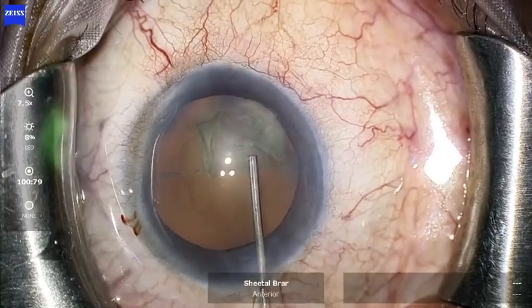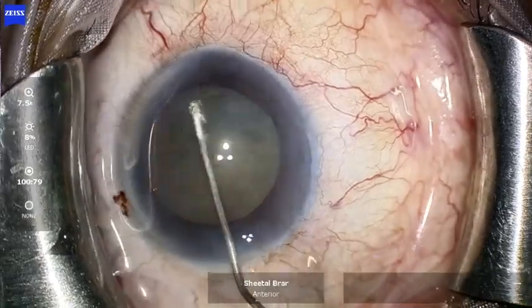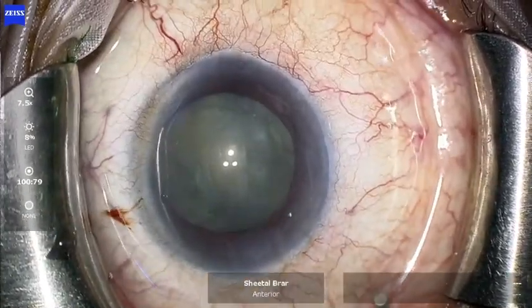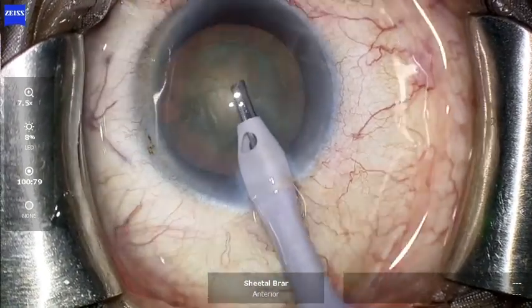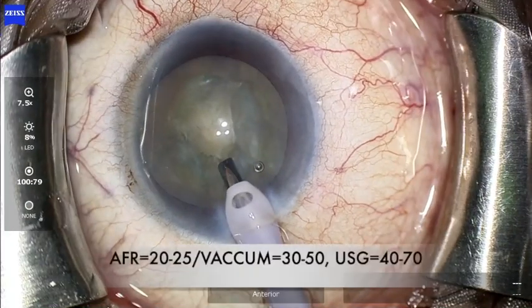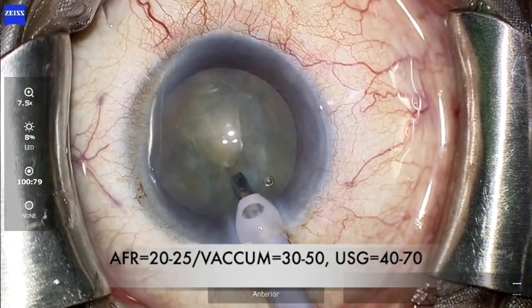The rexis is then followed by gentle hydrodissection and rotation of the nucleus. Before you start sculpting, ensure that the phaco tip is adequately exposed. The AFR at this stage should be between 20 to 25, vacuum between 30 to 50, and the ultrasound energy between 40 to 70 depending upon the density of the nucleus.